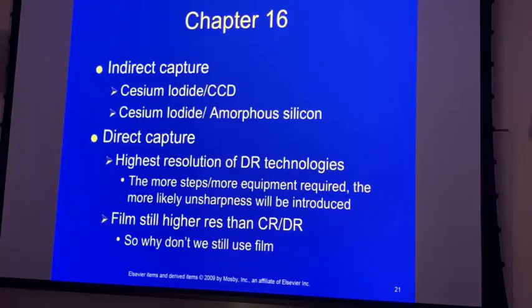And the reason we use the different elements that we use is basically the atomic number is high enough to create a lot of interactions with electrons. It's the same physics we've looked at since essentially day one of physics in your first semester. The higher the atomic number, the more electrons we can knock out of shells. So a higher atomic number is what we're after there.